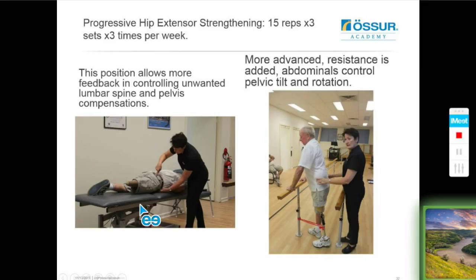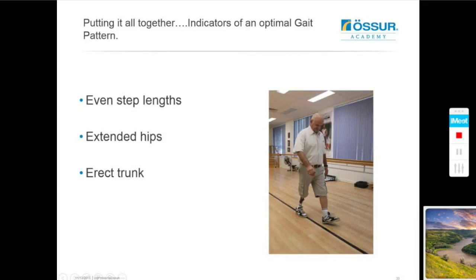We've talked about this position a lot today. It's a very important one. Maintaining good pelvic control, ASIS clamped down onto the bed, and squeezing the gluteal muscles, extending the stump up off the bed. We can then do it once they're wearing their prosthesis with a TheraBand here, helping them to control their pelvis while they're contracting their gluteals and extending the prosthesis backwards. And I will get them to think about walking and visualise their walking performance. So they're going from heel to toe, and at this position he's thinking about coming off the toe of his prosthesis and pushing himself forward off his prosthesis.